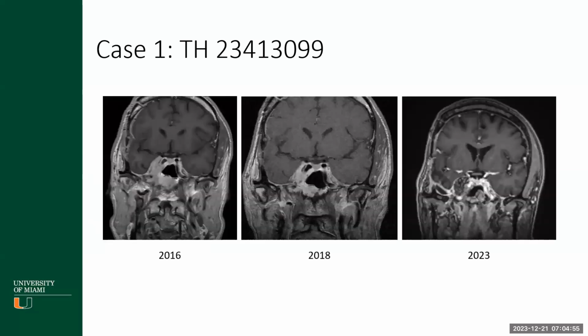When we're looking at the imaging, this is a contrasted scan. You can see multiple cuts through the skull base. You can see this relatively homogeneously contrast enhancing lesion that seems to be originating from somewhat of the middle skull base region where the clivus would be, that extends right more than left into that cavernous sinus. You can see in multiple cuts. You can also see a little bit of that encroachment into the temporal pole as well as that edema in this scan. So it makes sense as to the cranial neuropathies this patient is experiencing, particularly on the right side.